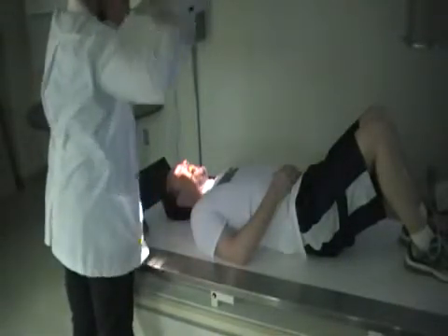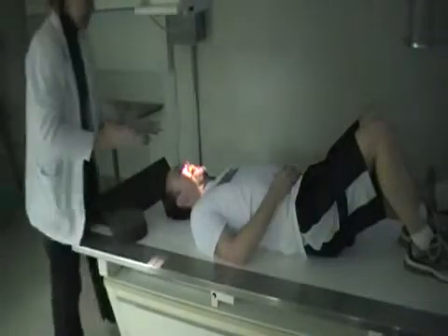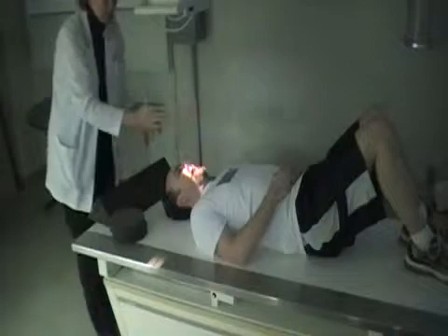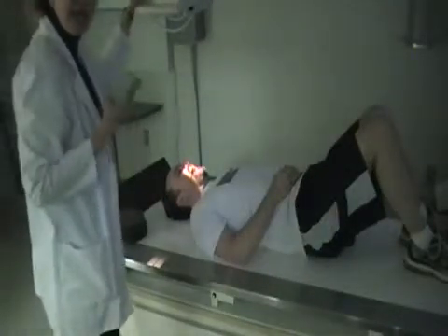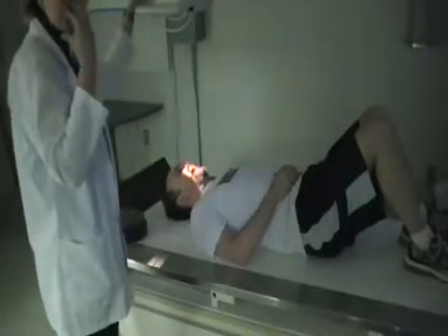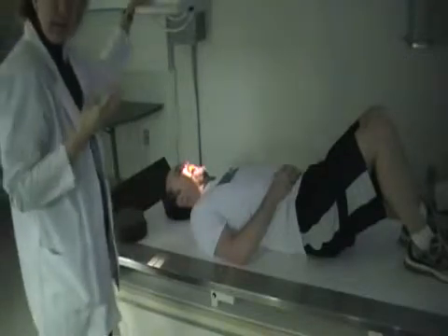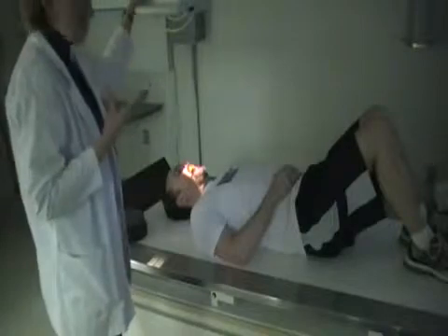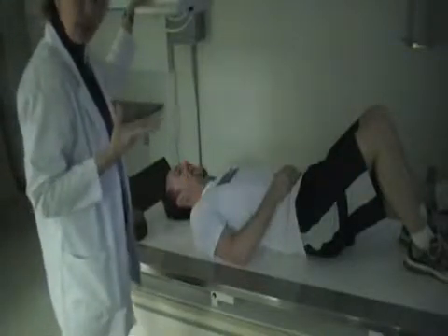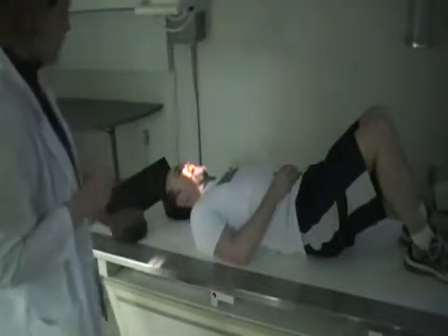Double check your light field. I am going straight through the mouth. Collimate down. Make sure that his head is straight, because you want it going mid-sagittal. Okay, now you can have the patient phonate "ah," and this just places the tongue at the bottom of the mouth. Now, not everybody's going to be able to do this. It all depends on if the patient is cooperative, because it is a trauma patient and you never know the situation there. But that is our open mouth.